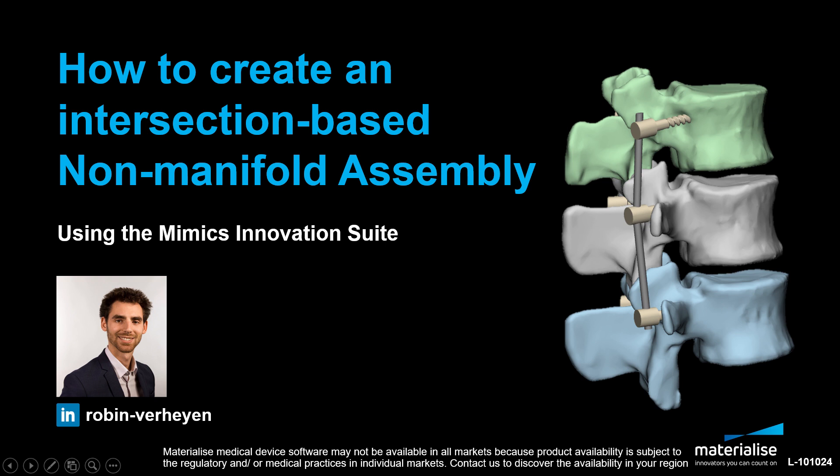Hi, my name is Robin. I'm a medical application specialist at Materialise in our headquarters in Belgium. Today, I will show you a few tips and tricks on how to create your non-manifold assembly for your finite element analysis.